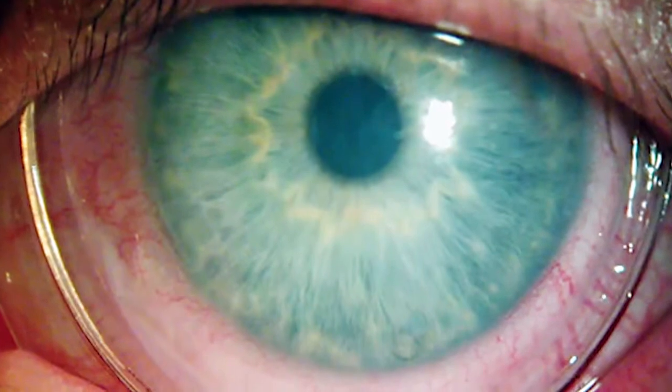So whereas normally I would have maybe taken this patient to the operating room for a superficial keratectomy and sutured on an amniotic membrane graft to promote healing, in this particular instance I was able to do a superficial keratectomy at the slit lamp in the clinic at the point of diagnosis, smooth out that cornea and place an amniotic membrane graft that was self-retaining, and be able to promote this patient's healing very, very quickly. So after the superficial keratectomy of this patient, we placed a Prokera graft on her for approximately 1 week.